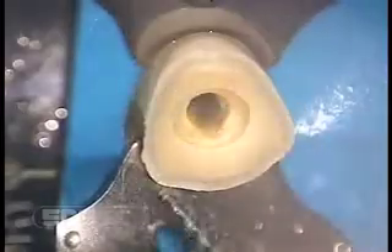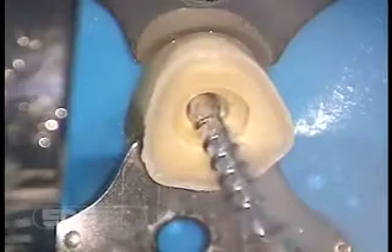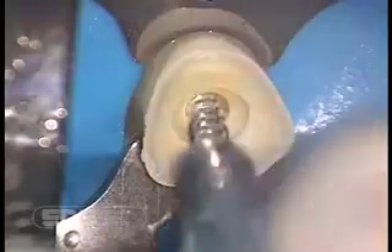Trial seat the post to determine fit. Make sure the second tier and flange are fully seated. If the flange does not seat fully, then the shaft of the post is too long. Remove the post from the root and cut the shaft from the apical end. In this situation, we are trial seating the post and the flange does not seat all the way — the flange is not flush.